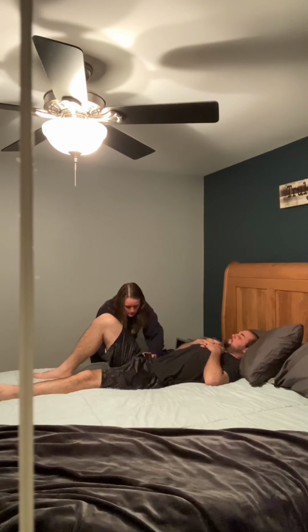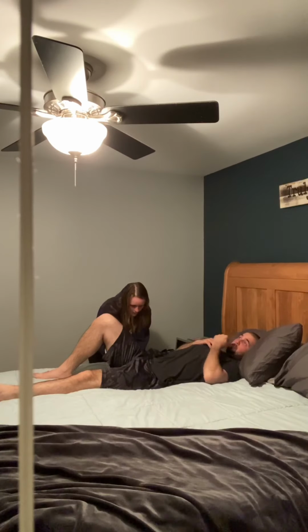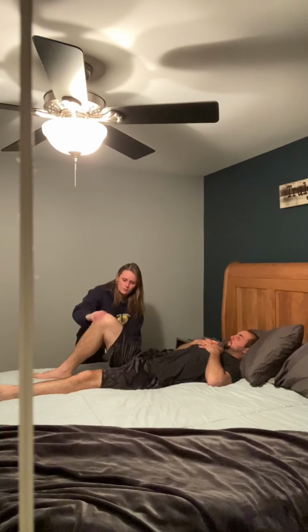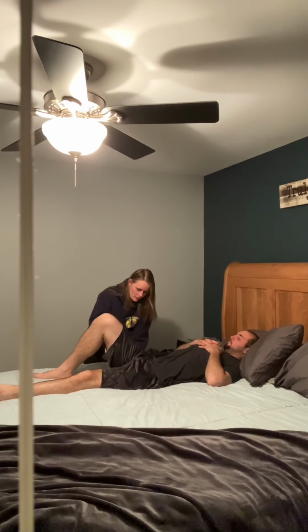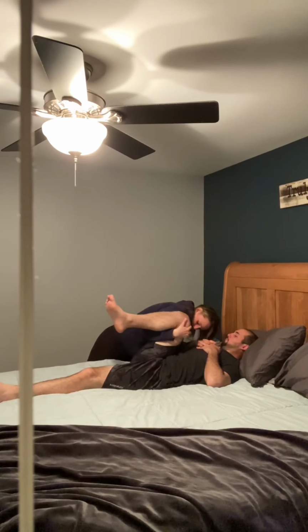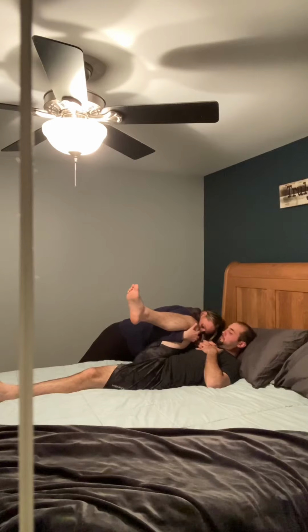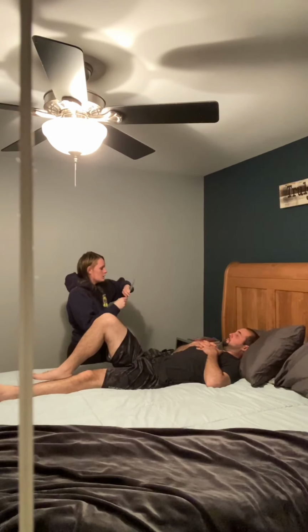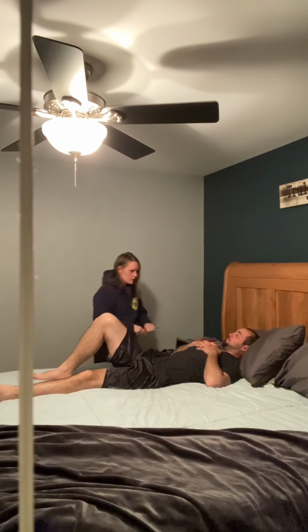Our stationary arm is going to be with the lateral aspect of the pelvis, and the moving arm is going to go with the lateral aspect of the femur using the lateral epicondyle. Our normal range of motion is 120 degrees. So we're going to come here, you're going to push him into flexion. Beautiful. Come back down. We are at 131 degrees for flexion.